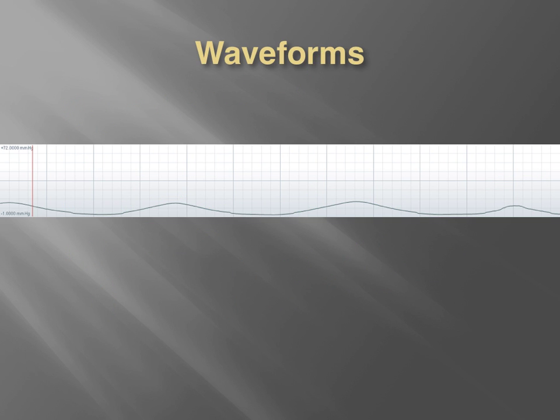So if you ever see a waveform that has this type of look, maybe even a little bit more pronounced, but we're getting rounding, start thinking that the ventilatory status may be inadequate simply from a poor tidal volume where the patient is not getting their true end exhalation in.